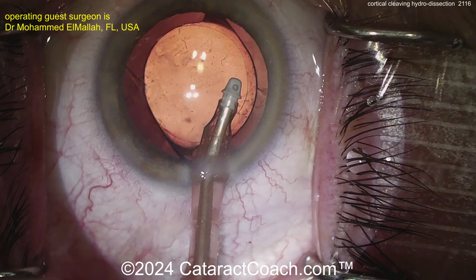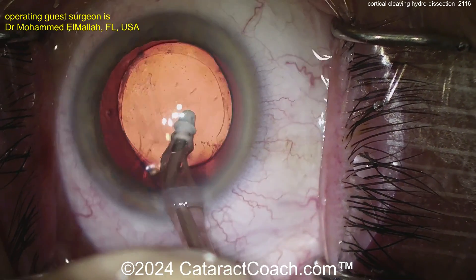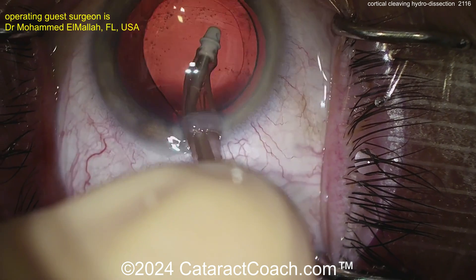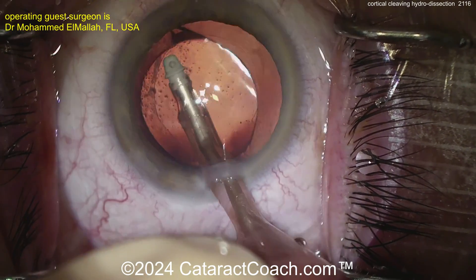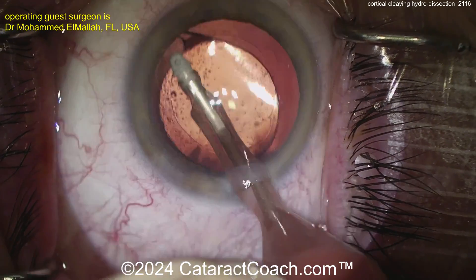The IA probe is able to clean up whatever little lens material is left and remove the viscoelastic — that's a clean case. Cortical Cleaving Hydrodissection works in roughly 80% of cases, leaving things cleaned up nicely without much cortex removal needed. It depends on the case and your technique, and as you do it more you'll get better and better.